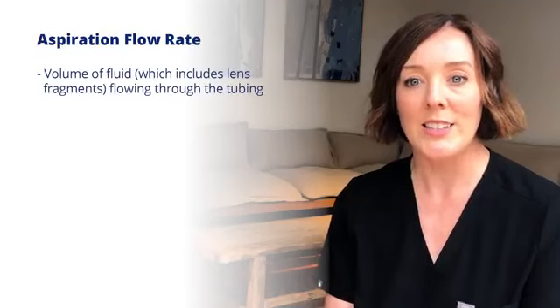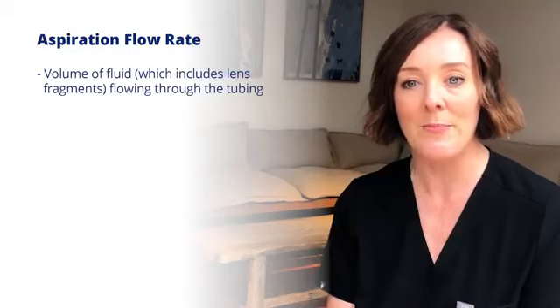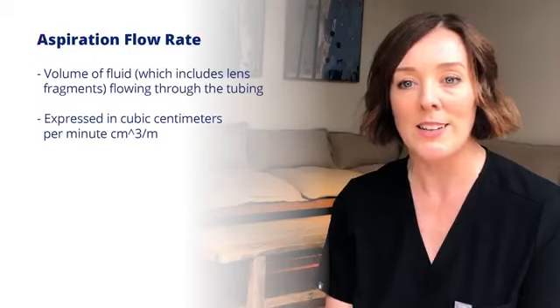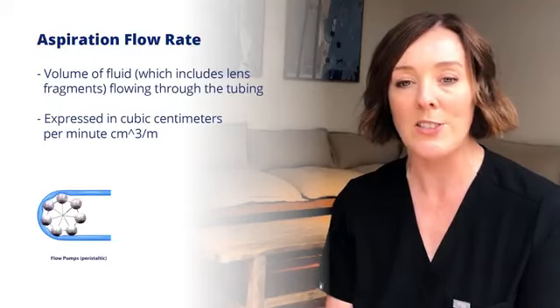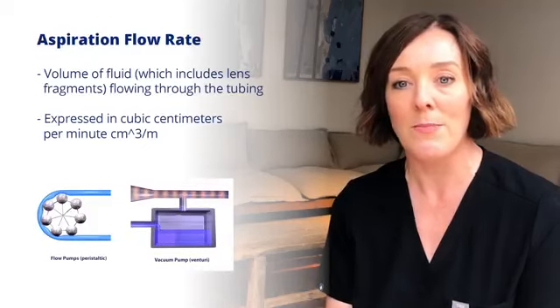Aspiration flow rate is the volume of fluid, which includes lens fragments, flowing through the tubing back to the machine at any given time. This is usually expressed in cubic centimetres per minute. The pump is the part of the phaco machine that brings fluid back via the tubing. The pump settings control the aspiration flow rate. The two main types of pumps in phaco systems are flow pumps, otherwise known as peristaltic, and vacuum pumps, known as venturi. Hybrid systems also do exist.